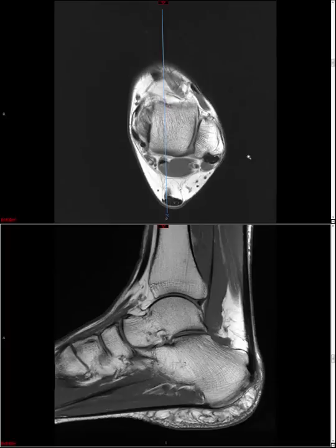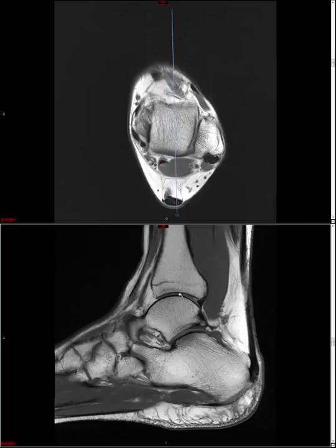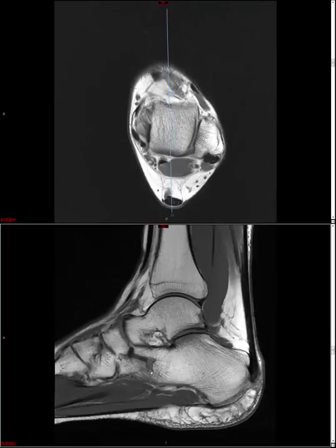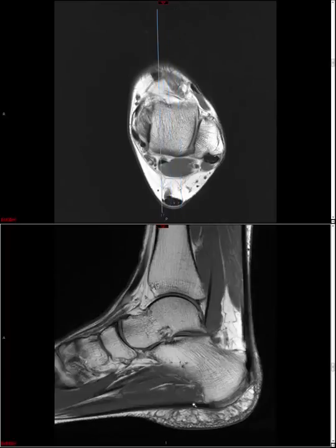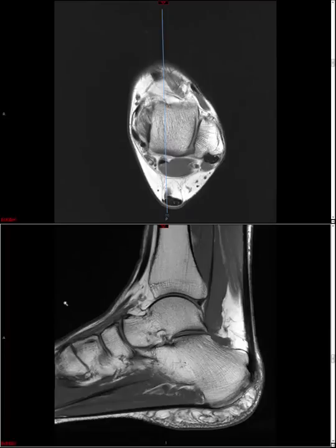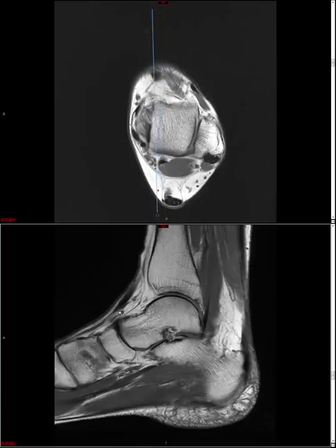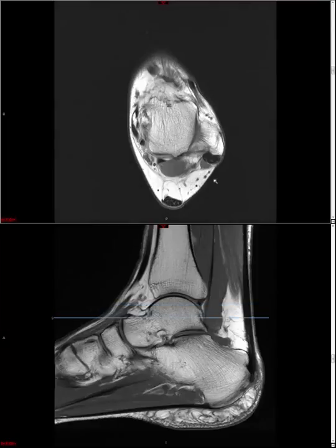In general, when I look at an ankle MRI, I basically break the study down into a few major categories. First, I look at all the tendons, then all the ligaments, then the tibiotalar joint, subtalar joint, followed by the midfoot articulations. I look at the sinus tarsi, then end by looking at the plantar fascia, and then a miscellaneous category covering the intrinsic musculature and marrow signal for incidental findings.